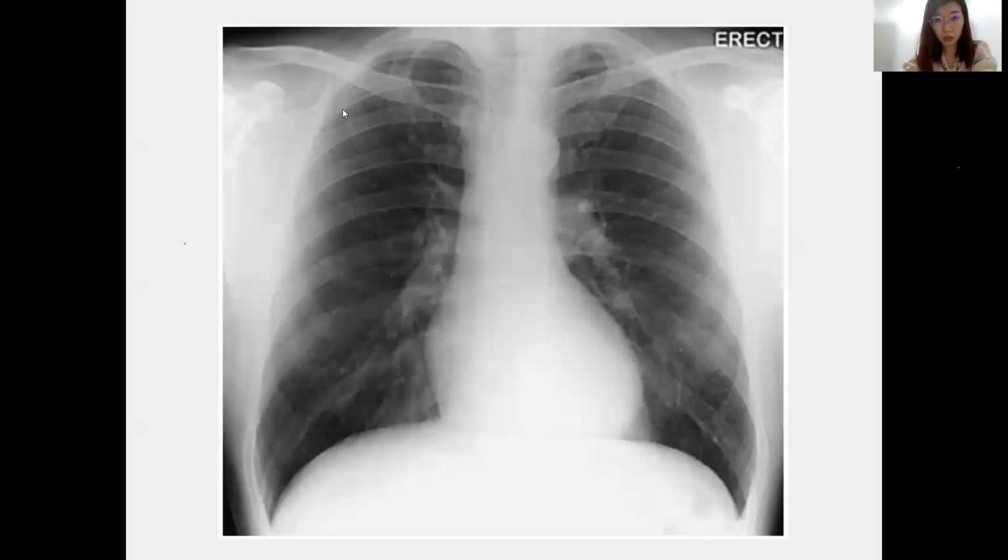Okay, so I need some of you to answer this X-ray. Please put your answer in the chat box. Anyone? Wait, give them some time. Anyone still following, already 10:00? Still at the chest. You know, everybody is here. Even Facebook also.